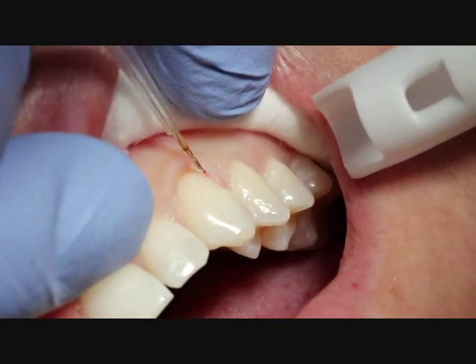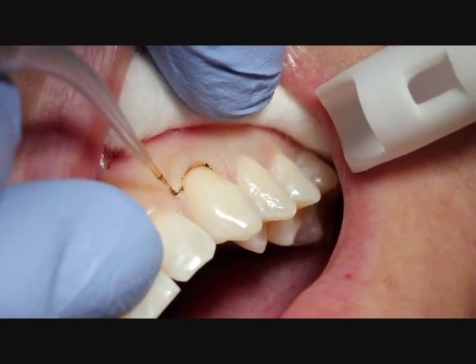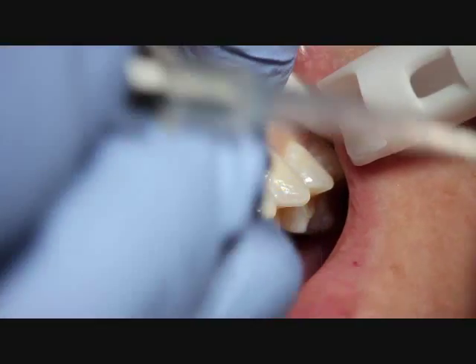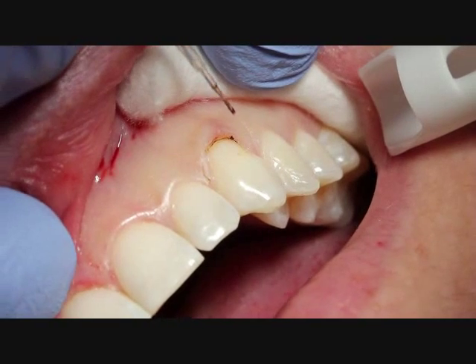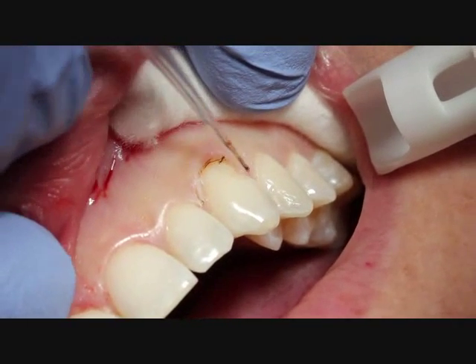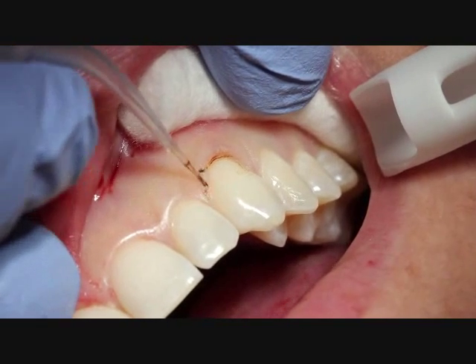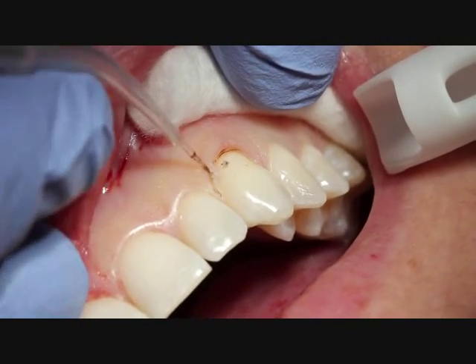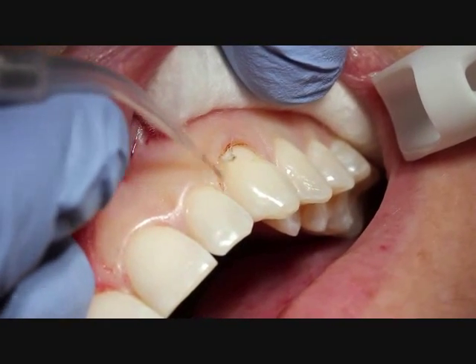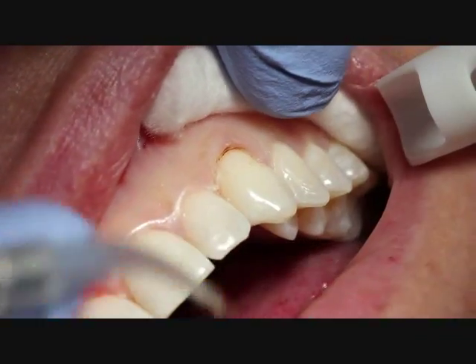Here we're starting to take a little tissue away. We're not going to be taking a lot of tissue away from the patient, but just enough to make the teeth appear a little longer, give a little more length and a little more cosmetic appearance. You can see we're just running the laser along, gently removing that gingival tissue, using it sort of in a paintbrush motion. You can see the tissue is just literally being wiped away.